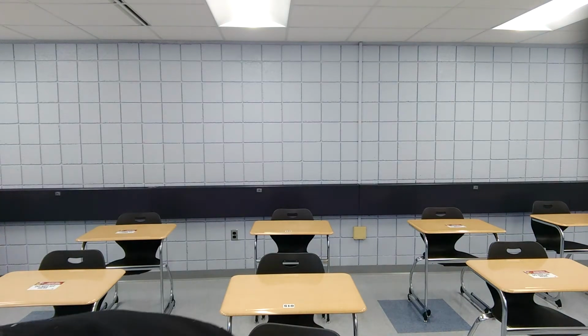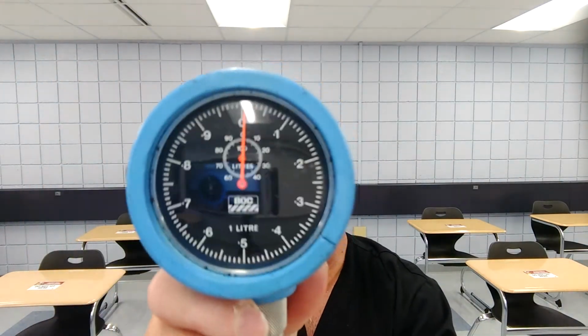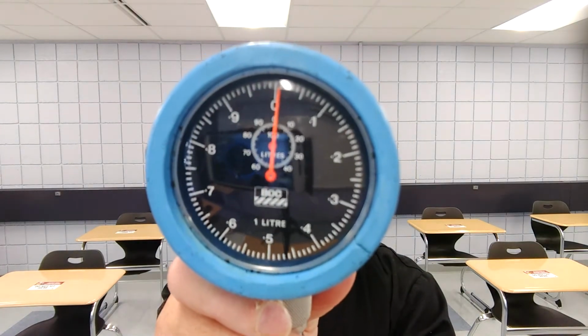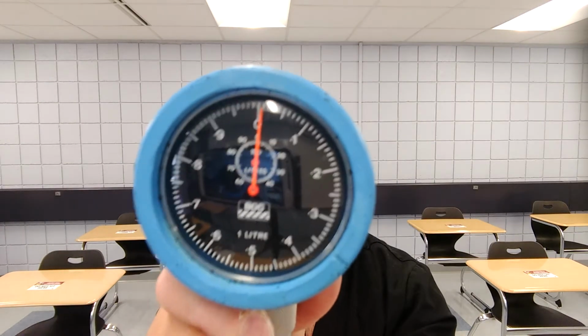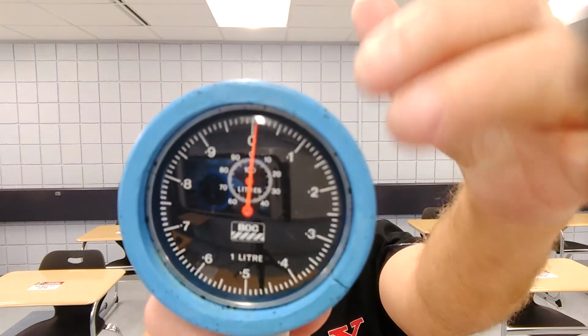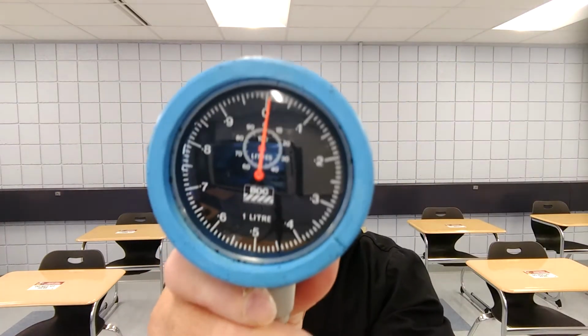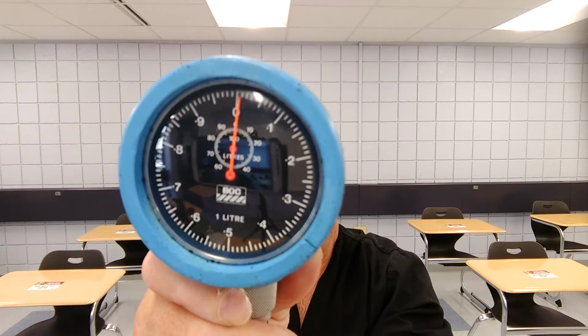Now, as far as respirometers are concerned, here's one idea of what a respirometer looks like. This is just one of them. What you see here, the red needle, when it goes around, goes in points. So you'll see 0.1, 0.2, 0.3, 0.4, all the way through, and then the numbers in between.